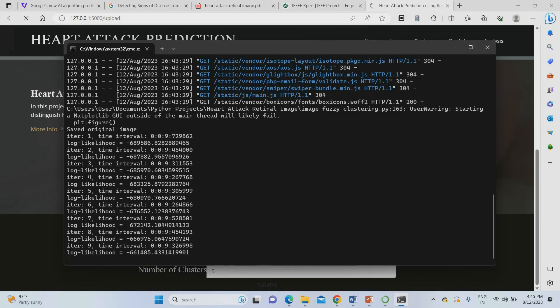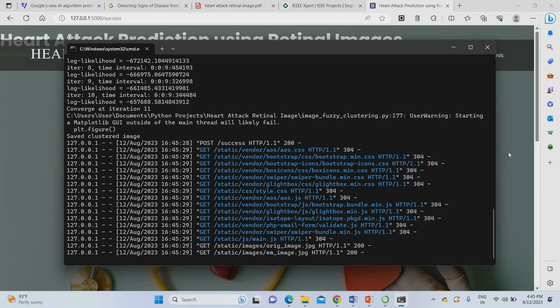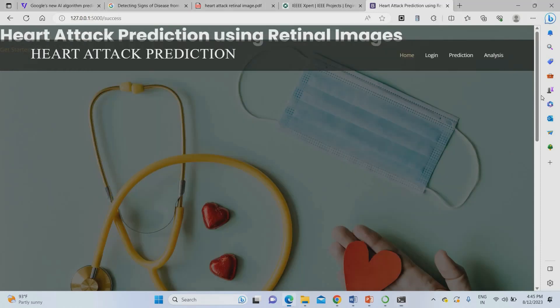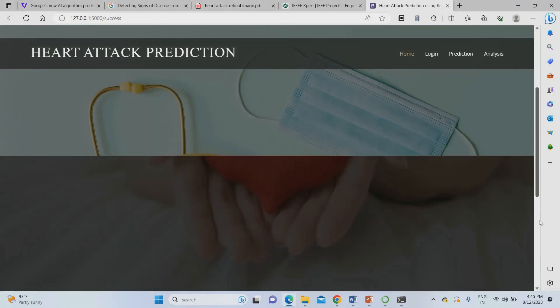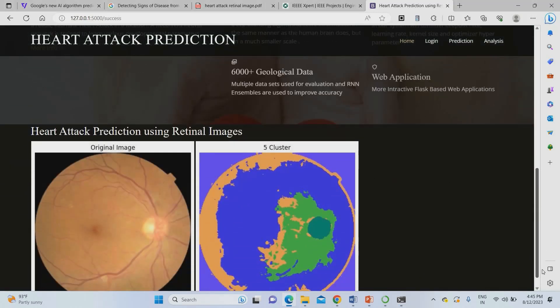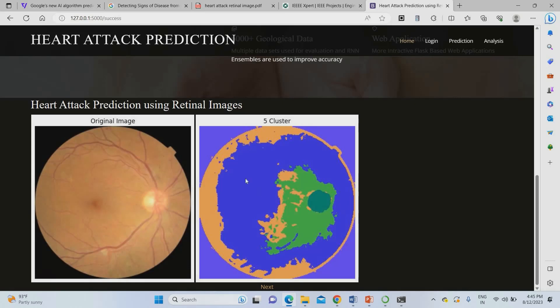Now iteration 9 is running, and we wait for 10 iterations to complete. Once the 10th iteration completes, overall training is complete. Once overall training is completed, it will go to the next page — the clustered results page. This shows the input images and their clustered results. Then you can go for the next results.